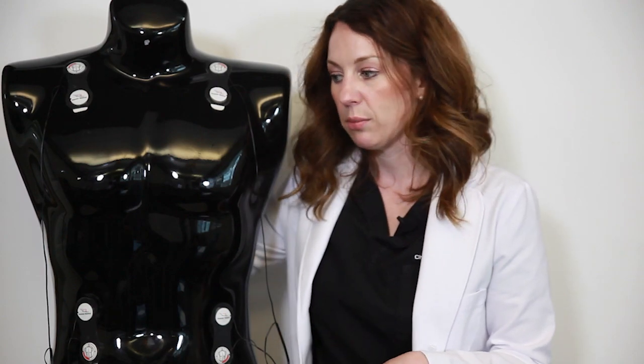Let's also talk a little bit about abdominal breathing. When your patient is particularly tachypnic and breathing really fast, you can just place all 4 sensors on the back if that's causing a lot of artifact in your patient. Feel free to go ahead and do that. We do that a lot sometimes in the emergency department.